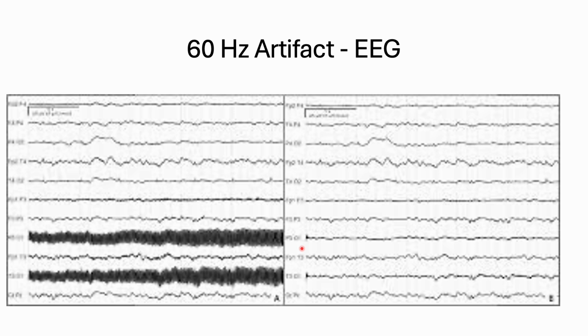Generally when sleep studies are run, there's the notch filter, or the 60 hertz artifact filter, basically. It tries to get rid of all 60 hertz frequencies in the study. Notch filter. Generally, everywhere I've worked, theirs are on all the time. You don't really want to have them on if you can help it, but there's so much electricity running through the walls and just everywhere that you can't really get away with not having it. So that's the way you can get rid of it.